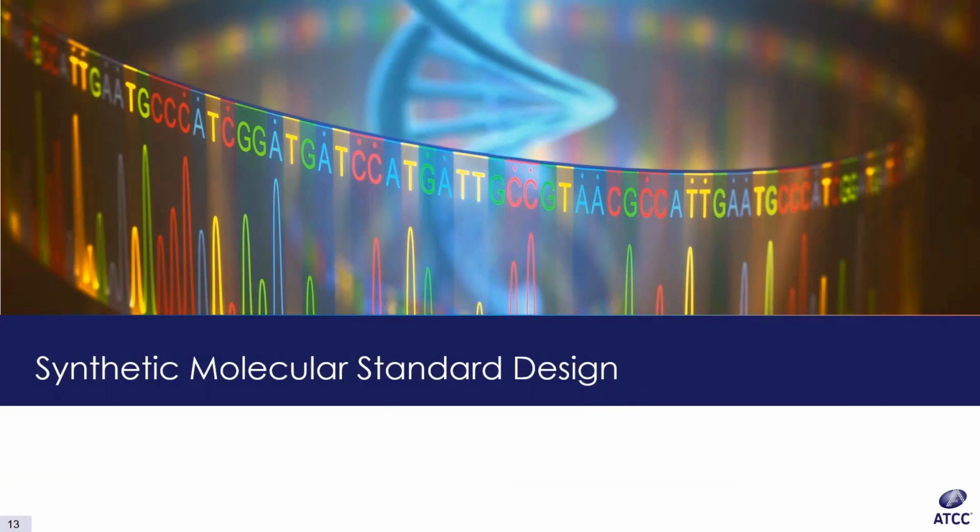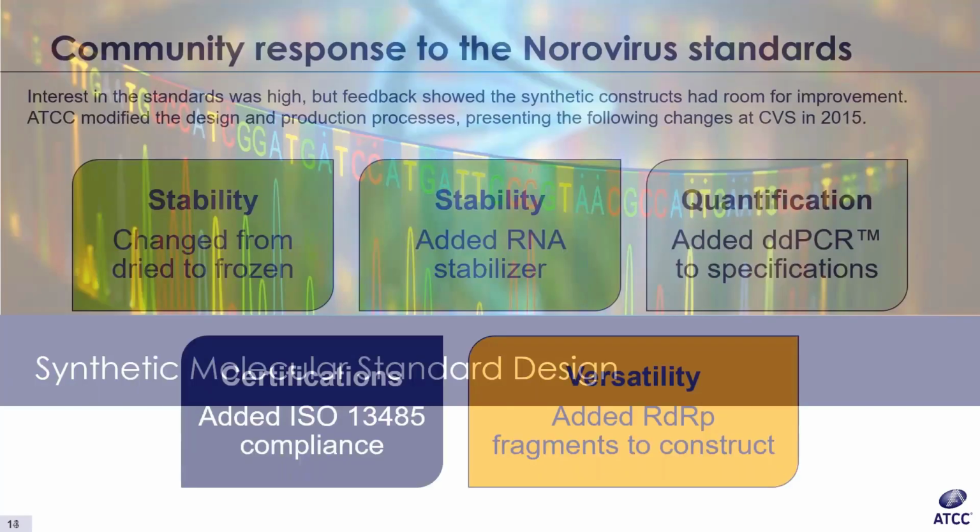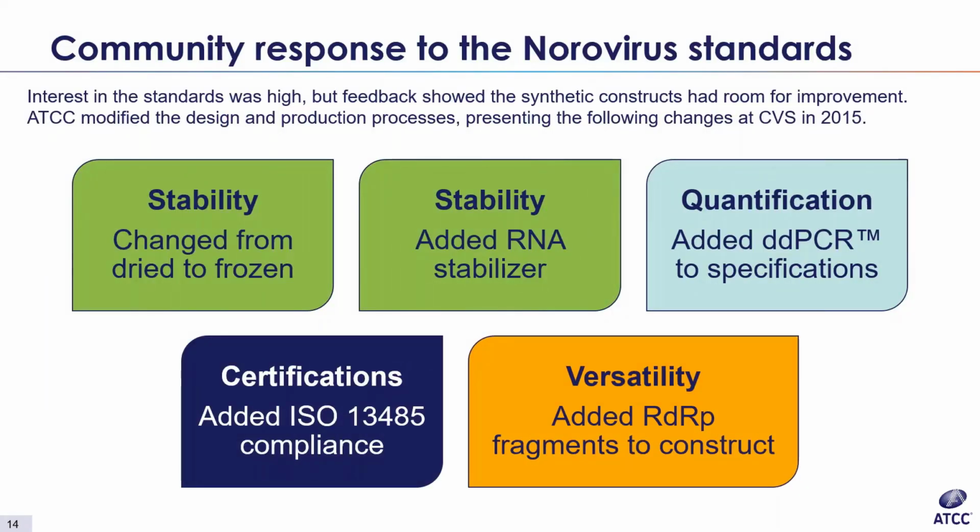Now I'll go into a little bit more depth into the design process of the synthetic standards. And I'll start with some improvements that we made to the first generation. While the initial interest in the standards was high, we found that there were some facets that could be better. Armed with lots of constructive feedback, we redesigned the norovirus constructs and presented the changes in a poster at the Clinical Virology Symposium in 2015.